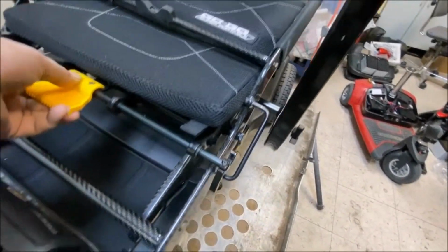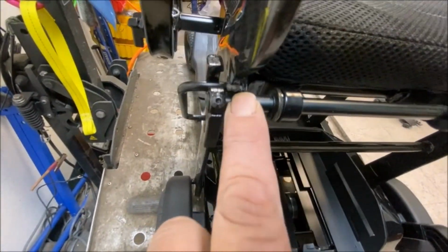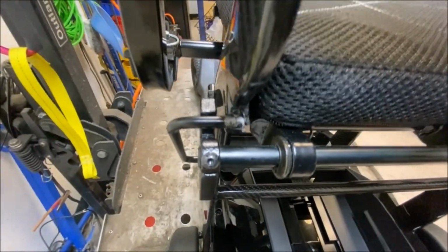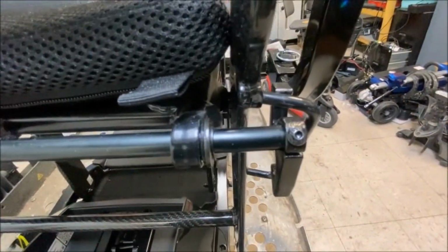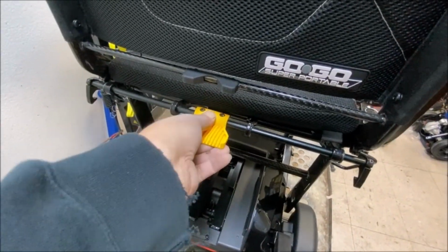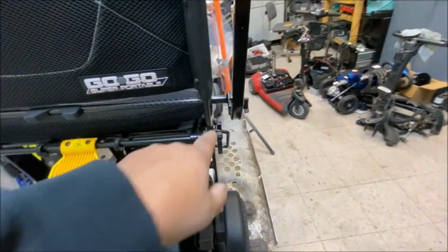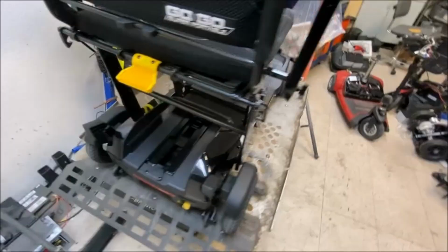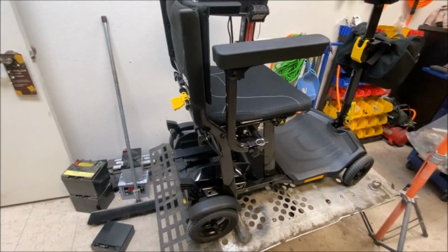And let me just bring them back up. It's not bad there, but basically it's the folding mechanism. You see it breaking away there. So that is kind of a weak point on these chairs, so be careful if you do own one of these. Make sure you use the release handle to release the seat, because otherwise they can break. Not a cheap fix because it's part of the carbon fiber frame seat back, so it's an expensive repair.